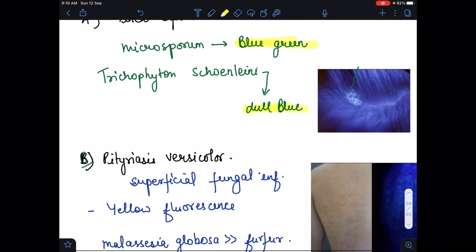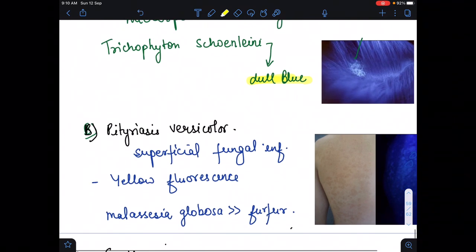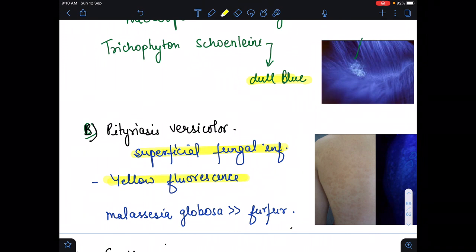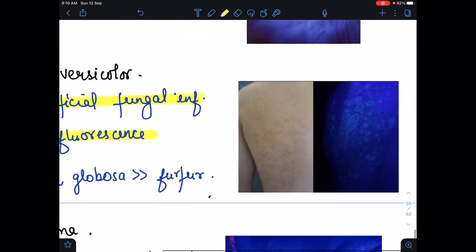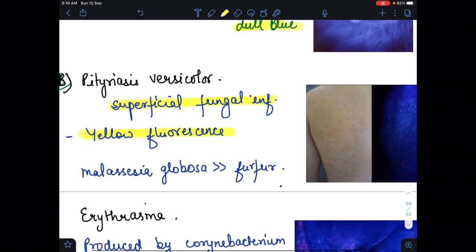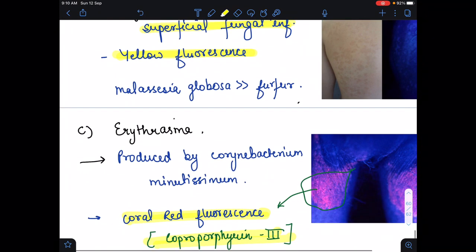The next one is tinea versicolor, which is a superficial fungal infection. On the Wood's lamp it shows yellow fluorescence, and it is more common with Malassezia globosa than furfur. In this image, we see this yellow color, so it is tinea versicolor.